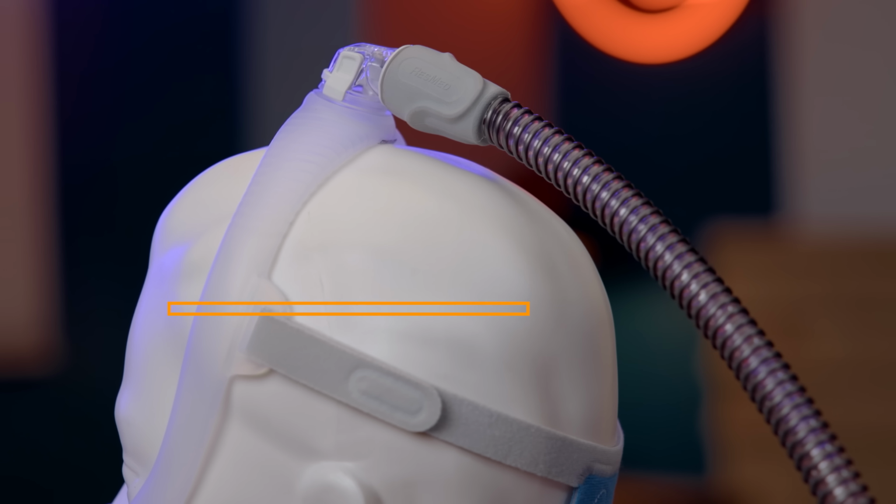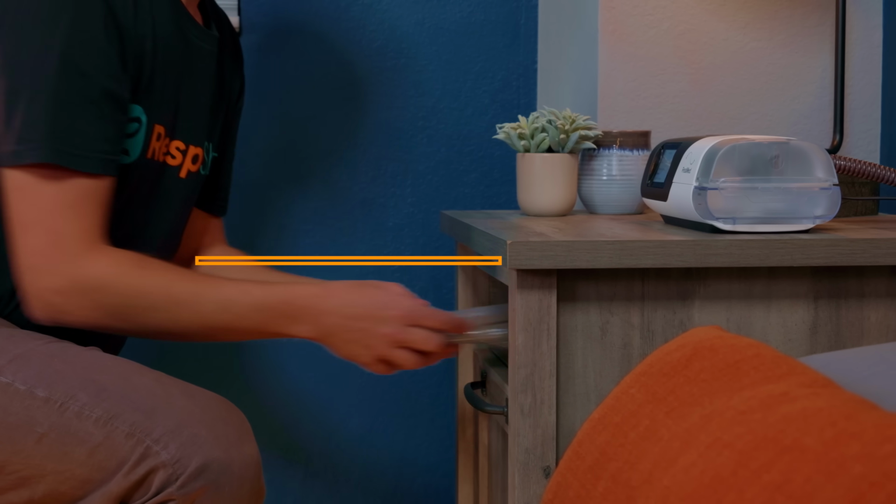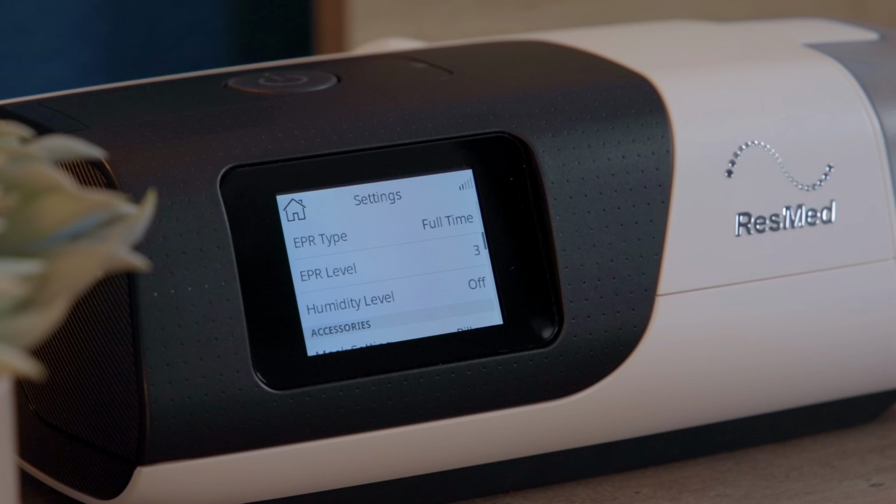The next setting depends on whether you have climate line tubing or slimline tubing. If you have slimline tubing, the next setting you'll see is humidity level, so let's start there.